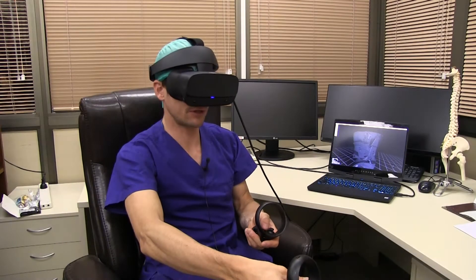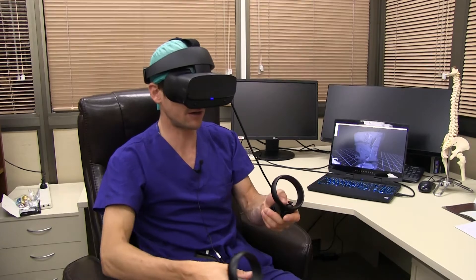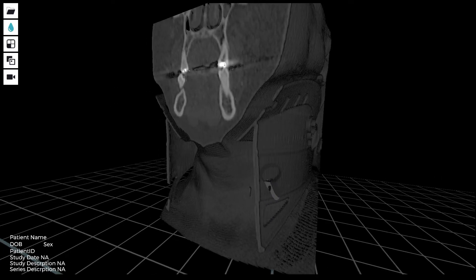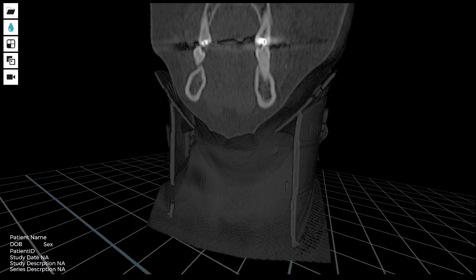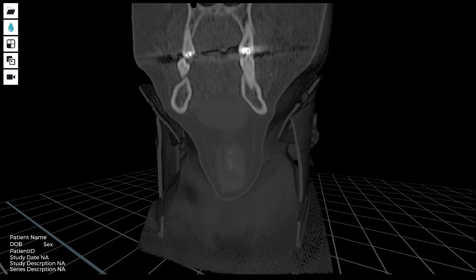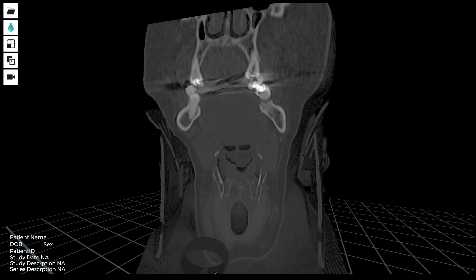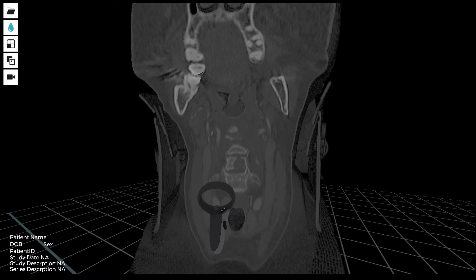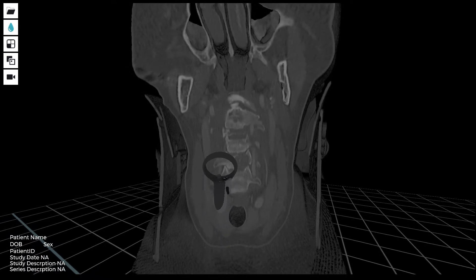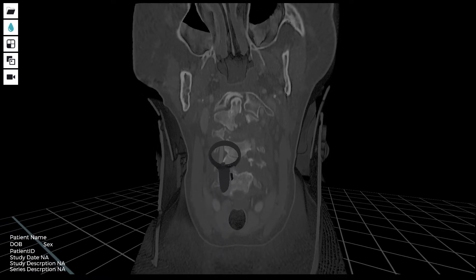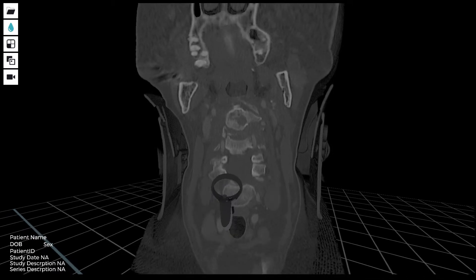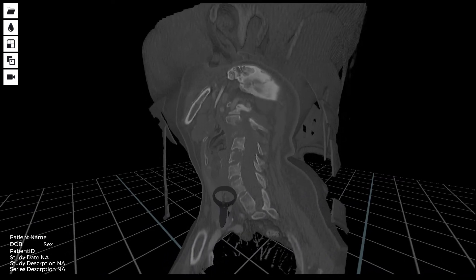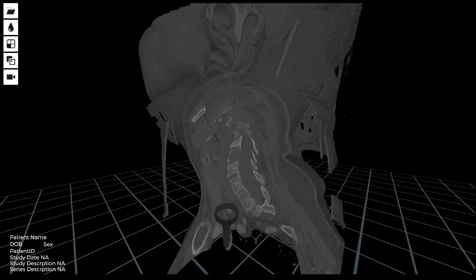Now I look at this patient's scan in VR. She was placed in a collar at the moment of the scan. I can place her cervical spine in any position and go through her structures with the intersect tool. I can clearly observe the vertebral bodies involved — the C2, C3, C5 vertebral bodies are involved. There is also a change in the sagittal alignment of those vertebral bodies with segmental kyphosis at the C3 level.